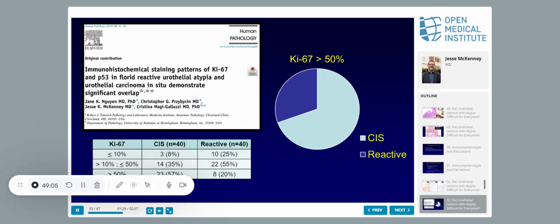Because I got two cases. We said two months ago that it was a small area because the biopsy was not great. There's two small areas. I'm suspicious for CIS. I don't know what to do. I find one mitosis, and there are some cells, like here's four or five big cells. I did the immunohistochemistry, and it did not support me. So I'm afraid to write CIS. I wrote that immunohistochemistry did not support my suspicion of CIS.